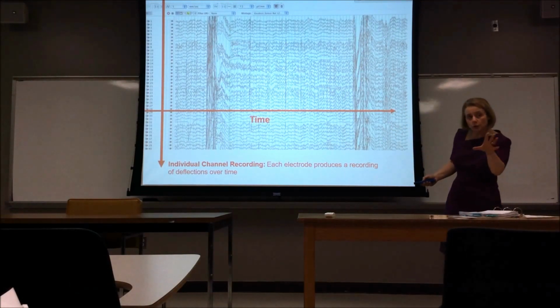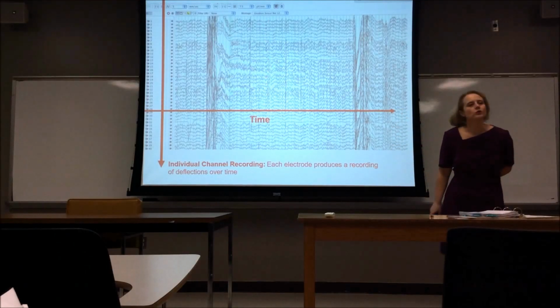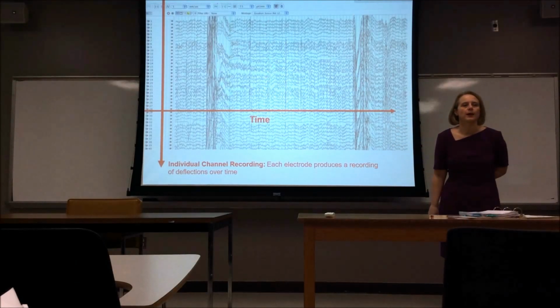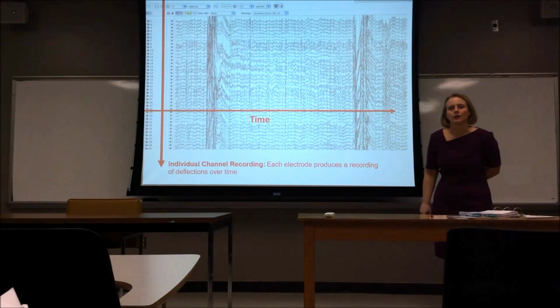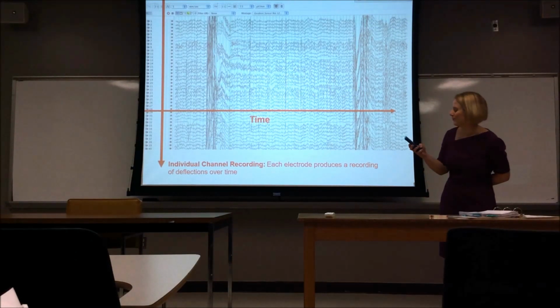Now you might notice, because you guys are pretty far away, that there are these points here. See these? If I were to magnify them, those stupid things are heartbeats that I allowed to get into this signal. In other words, I'm not showing you perhaps the best EEG I should have for this demonstration.